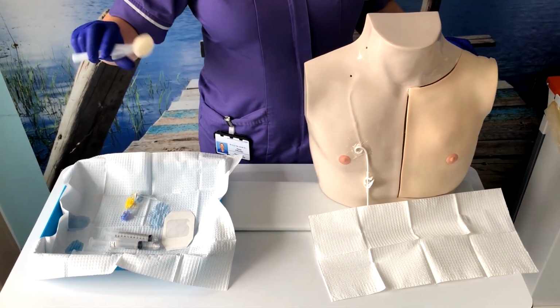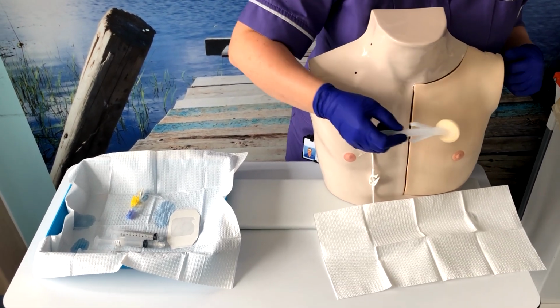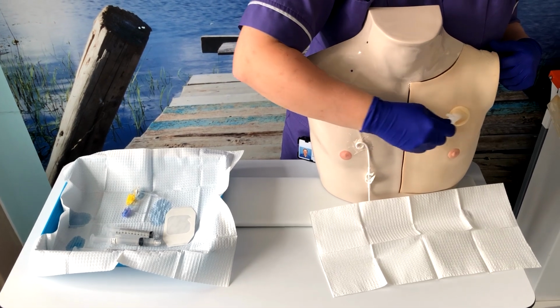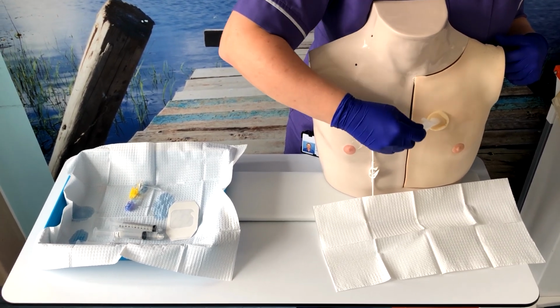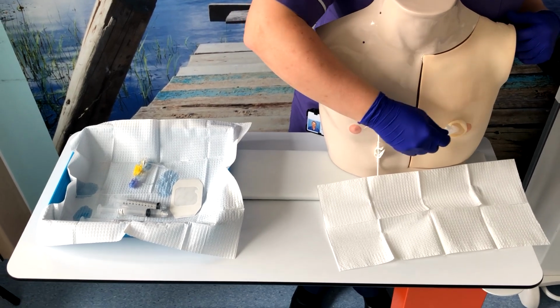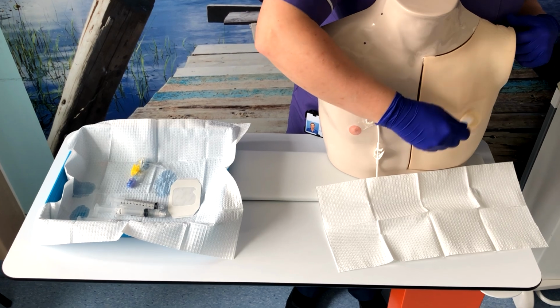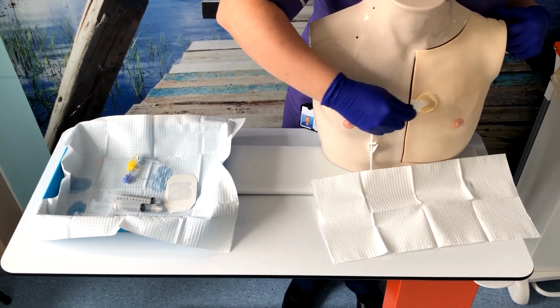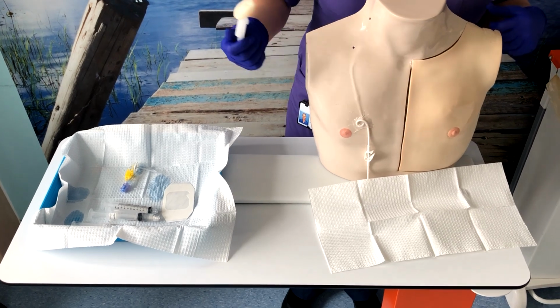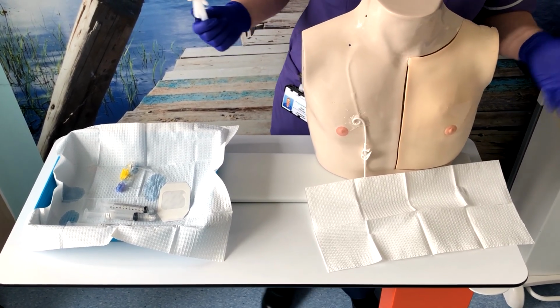So first we are going to clean the port. So using our Chloroprep, we're going to go in an up and down and side to side motion to make sure we are covering the whole area. And we're going to do this for 30 seconds. And then we're going to allow that to dry for 30 seconds before we access the port.